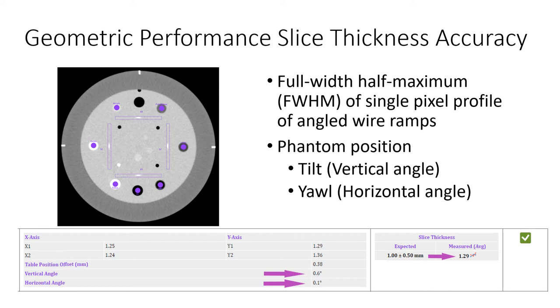An estimate of the full width half maximum is determined to establish sampling locations for baseline correction. Using this new baseline corrected profile, the final full width half maximum is calculated by linear interpolation, and the z-axis measurement is reported as a product of the full width half maximum and the tangent of the ramp angle. The application of a smoothing filter to the ramp profile data may be implemented with criteria based on a combination of expected slice thickness and image noise.